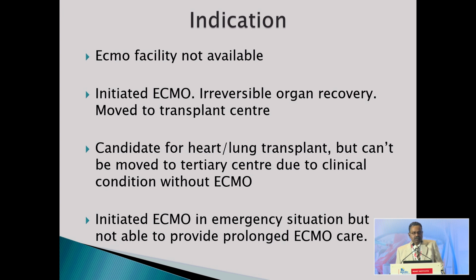Rather, we can place an ECMO and then transfer them, and it will happen in a much more controlled environment than transferring these patients without ECMO. The next group of patients are those where ECMO was initiated in an emergency situation, but the team doesn't have enough experience to manage the patient in a prolonged manner. So these kinds of patients also need to be transferred.